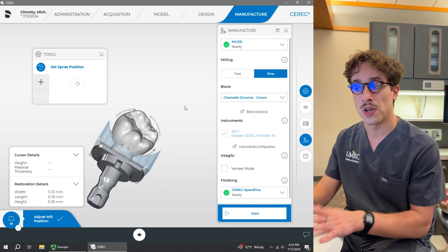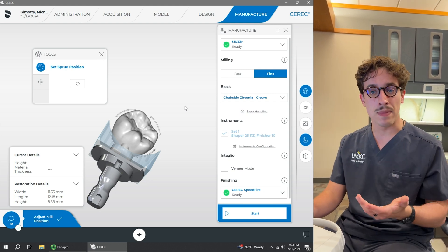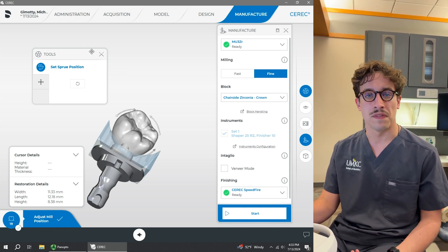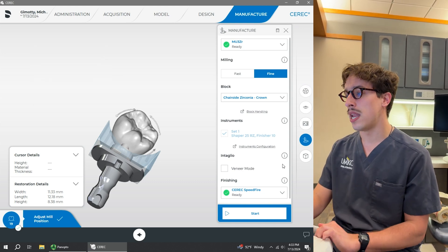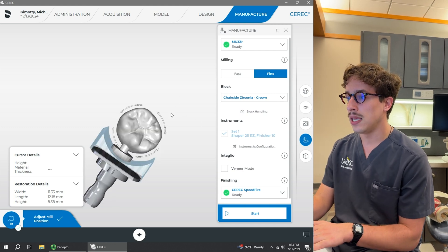There's no red portion, so the sprue is ready to go. One thing to note: if we are milling in emax, it will not generate a sprue because of the way that it mills, so you normally don't have to set the sprue position with emax. Now that we've got the sprue in the correct position, we're going to make sure that we have it selected correctly in the milling unit.